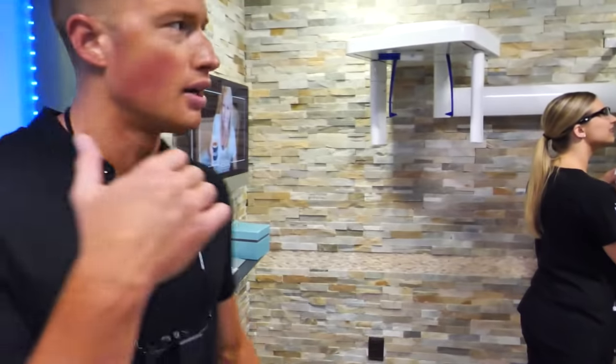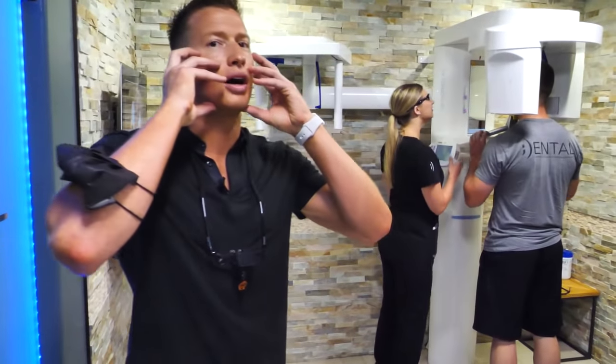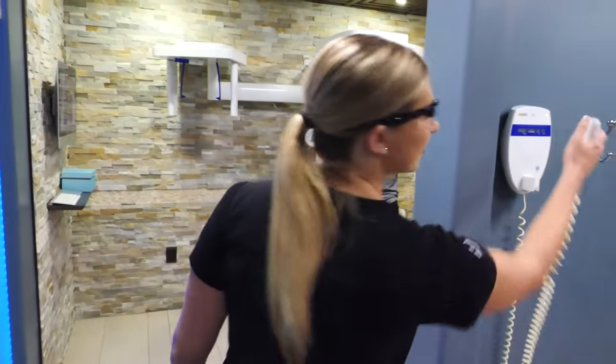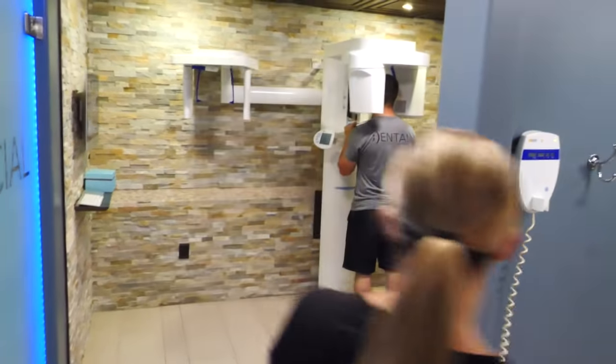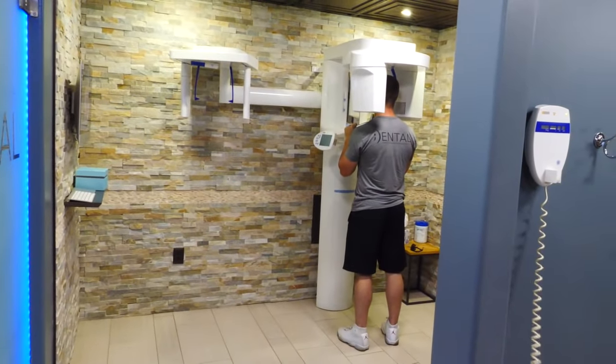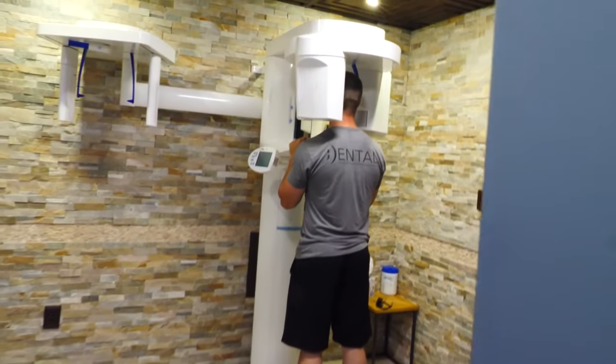With this machine, one pass will give us a three-dimensional impression of this whole region, so we'll be able to capture all the data we need for planning this implant. You'll see it takes about 18 seconds or so. It's under 20 seconds to do one image, and it's a single pass.